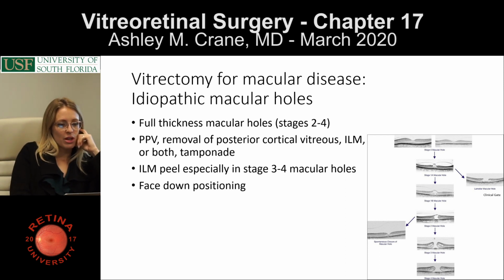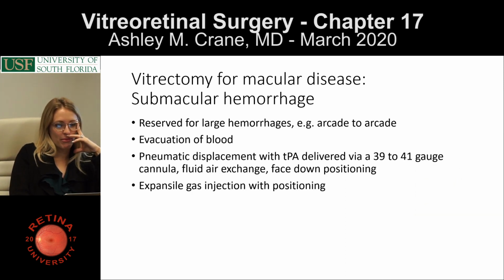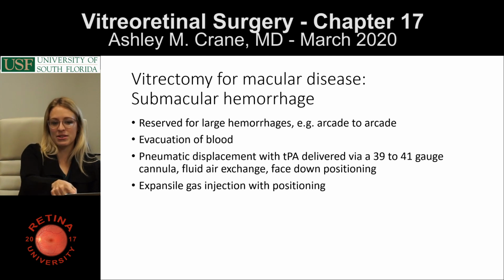So there's also vitrectomy for subretinal or submacular hemorrhage. This is not necessarily that common, although I imagine there are some surgeons who really think this works really well and other surgeons who don't. And I think on a population basis, it's not super common. Individually, I did this on a couple of patients, and one patient was 20/25 afterwards. I think it was this guy actually, and I'll show you a video of that. But in general, it's not proven to be any better than anti-VEGF.